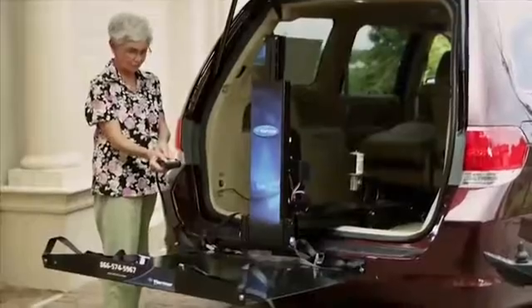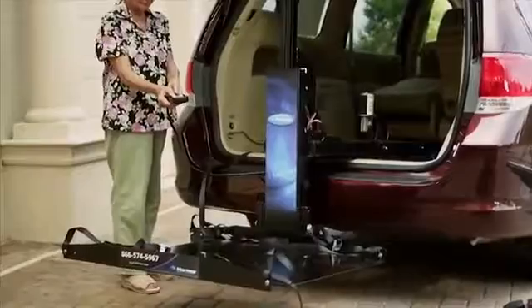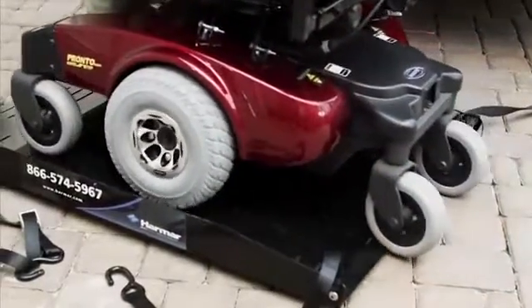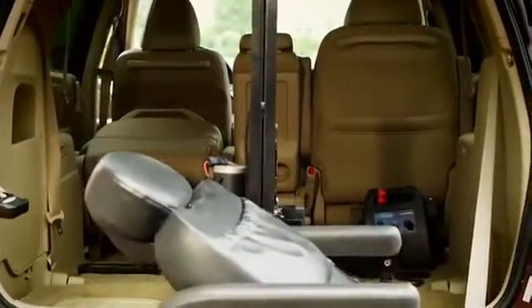It's so easy for Grandma to use her Harmar AL600. The AL600 is the most compact hybrid lift on the market. The compact design allows it to fit inside many minivans and SUVs without giving up your second row seating.